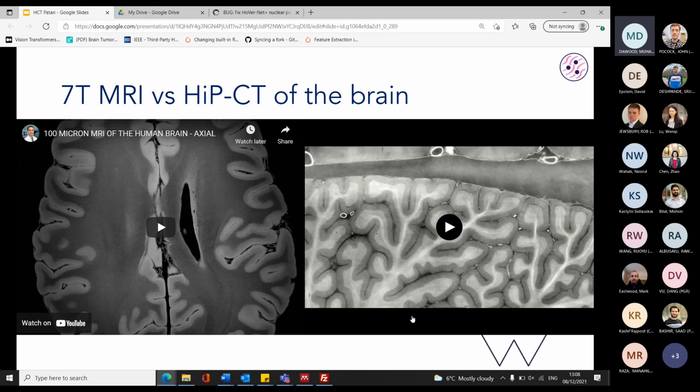To get higher resolution with an MRI scanner, it needs bigger magnets, and these magnets are already getting huge. A 3T scanner costs maybe 2.5 million sometimes, so never mind what a 14 Tesla scanner would cost.